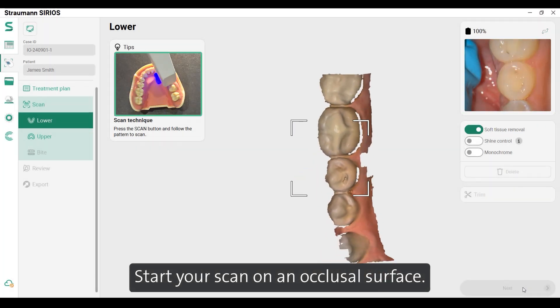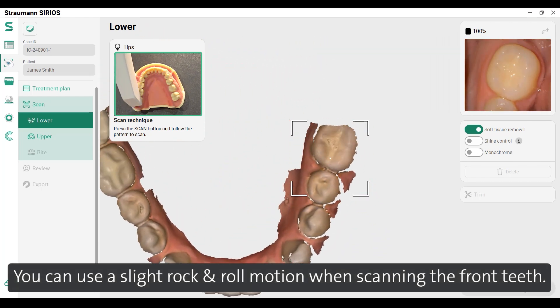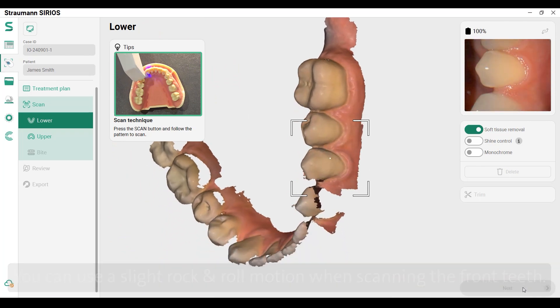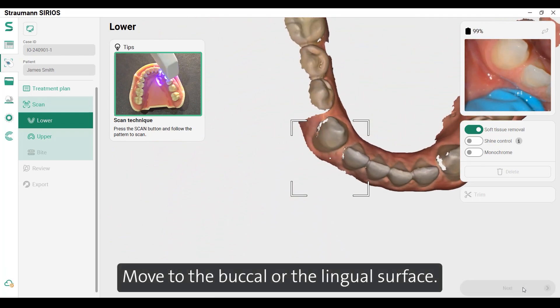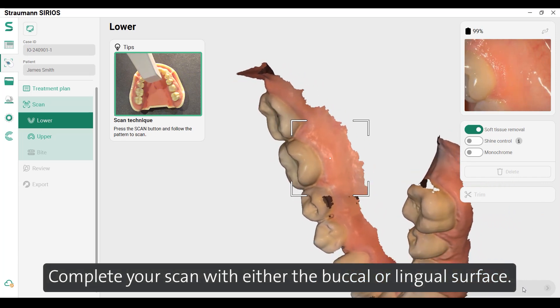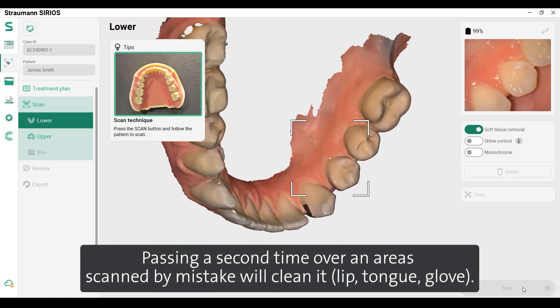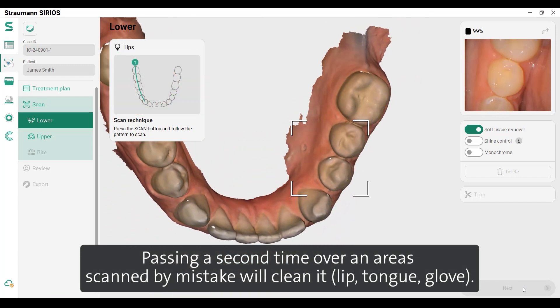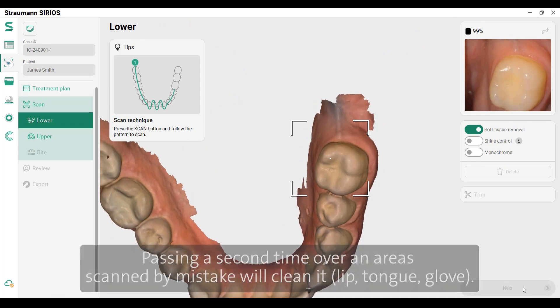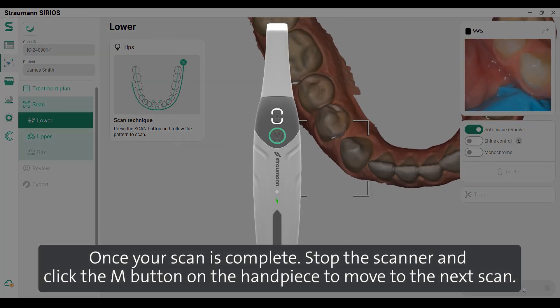Start your scan on an occlusal surface. You can use a slight rock-and-roll motion when scanning the front teeth. Move to the buccal or the lingual surface and complete your scan with either the buccal or lingual surface. Passing a second time over an area scanned by mistake will clean it — lip, tongue, glove.